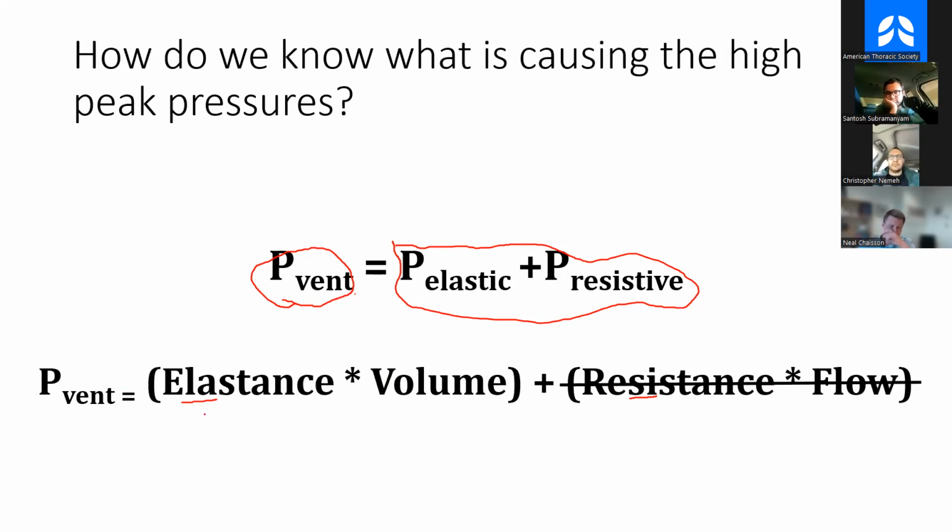And so in fact, the respiratory therapist says, hey, I did a plateau pressure, and their plateau pressure was 14, okay? So that means that there's 20 centimeters of water of resistance now. You go, oh man, that's a lot of resistance, right? In a normal person, if I put you on a ventilator, your resistance would be like 1 or 2 centimeters of water, okay? So the question is what might cause that resistive pressure to go up? Anyone have any ideas?